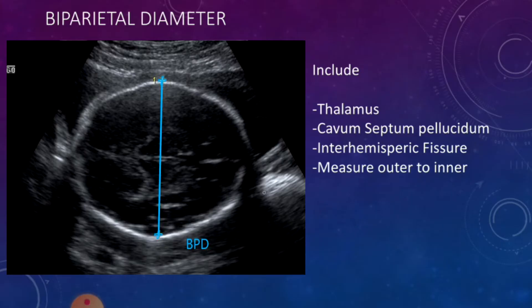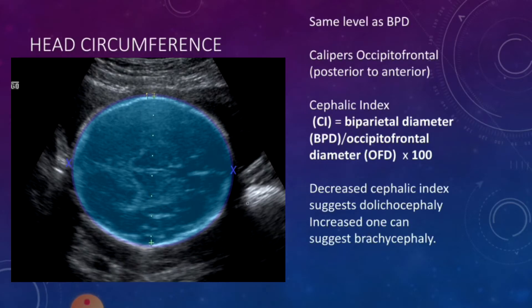The first measurement you're going to take is a biparietal diameter. At that level, you want to put the calipers from the outer cranium to the inner cranium. Once you finish that measurement, you're going to take a head circumference by putting the calipers in the anterior and posterior, or occipital-frontal, areas of the head in the same view, then open the ellipse and measure the circumference.